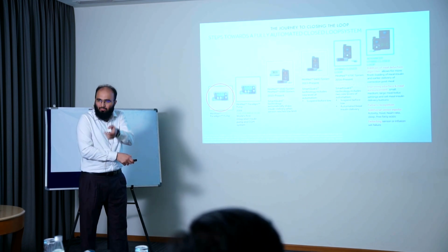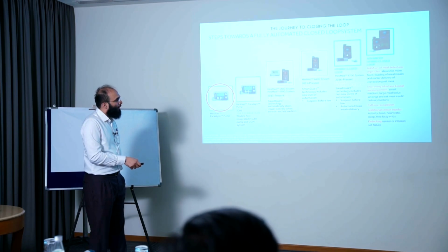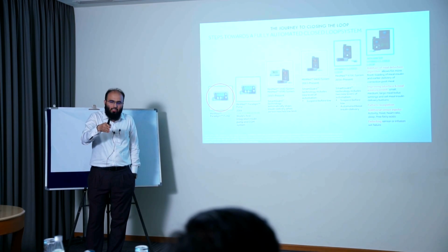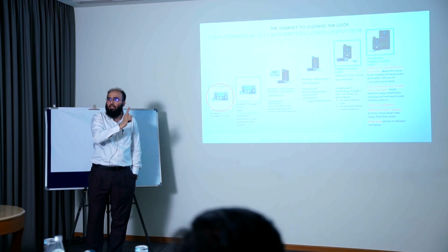So meal announcement, just that down button for meal announcement. Pattern recognition. If the sugar was say steady for some time and is rising at more than 2 mg per deciliter per minute, now it knows that there is some carbohydrate entry in the system.